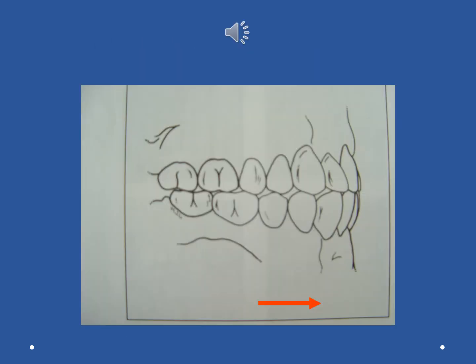Here, during protrusion, the mandible slides along the incisal guidance angle. Both anterior and posterior teeth should remain in contact in complete denture. This will enhance the stability of the complete denture.